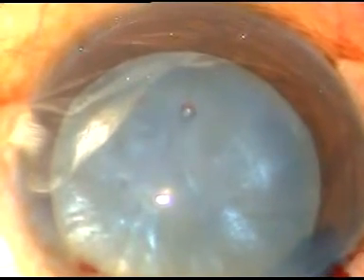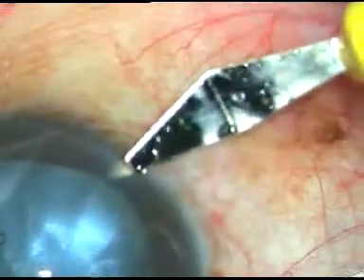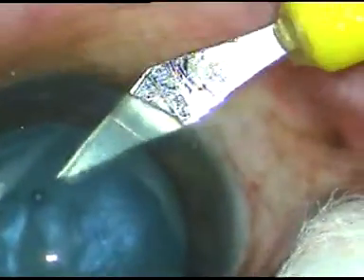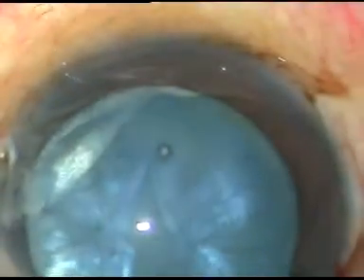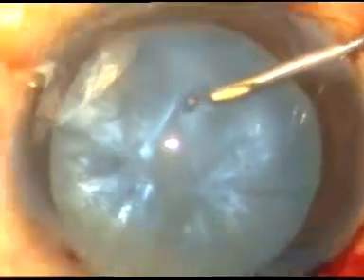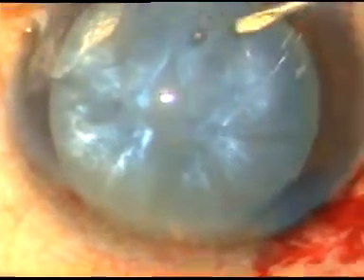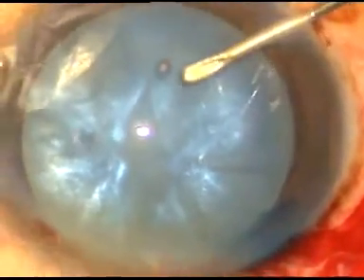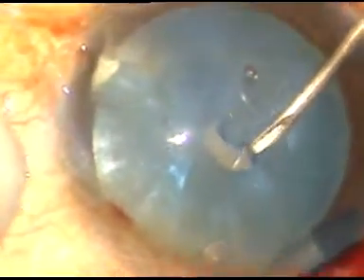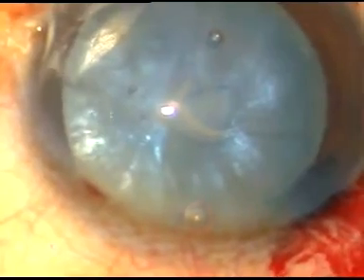Now capsulorhexis is to be done. But before that, we have to do this side port. This is a side port on the right side of the main incision. Now the needle goes through this side port. The anterior capsule is incised and an attempt is made to make a C flap — that means you make a puncture and draw the needle in such a way that it becomes a C flap.